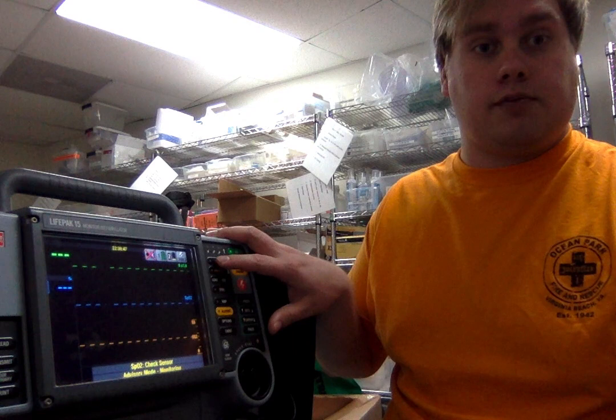This machine will also turn on a metronome if you click the CPR button, to allow you to know whether you're doing your compressions slow or fast.